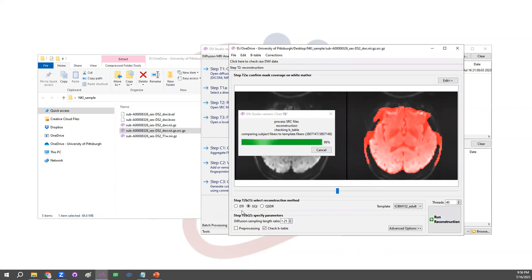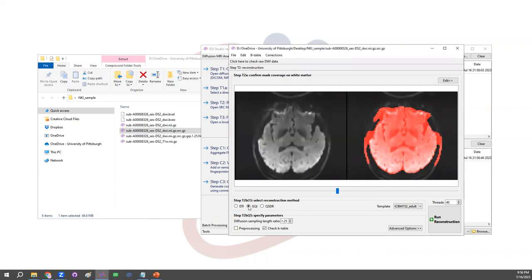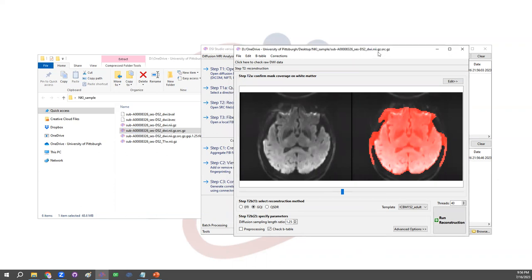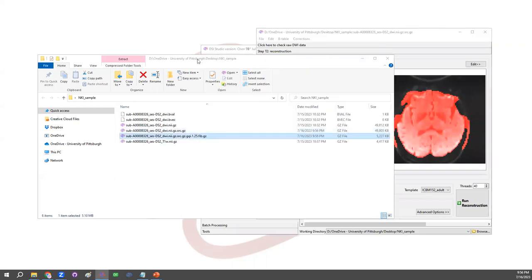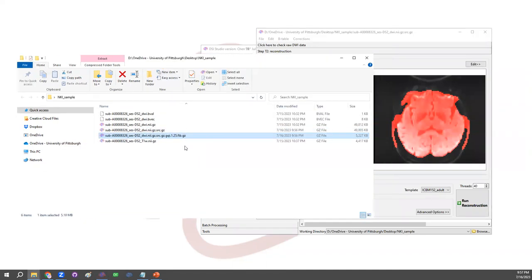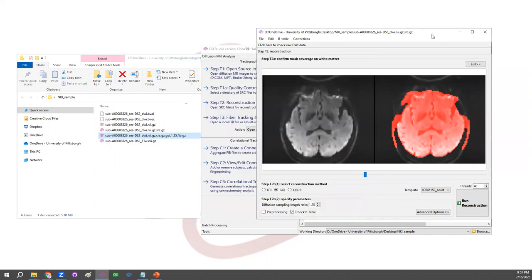So here we just go straight to the run reconstruction. And for other methods like DTI, the brain mask would make a difference. Up here, we are using GQI reconstruction. Usually the mask, the default mask will be good enough. After the reconstruction, DSI Studio generates a file with this extension, this .fib.gz. So this file includes data that for each voxel, there will be fiber orientation that enable us to run fiber tracking.